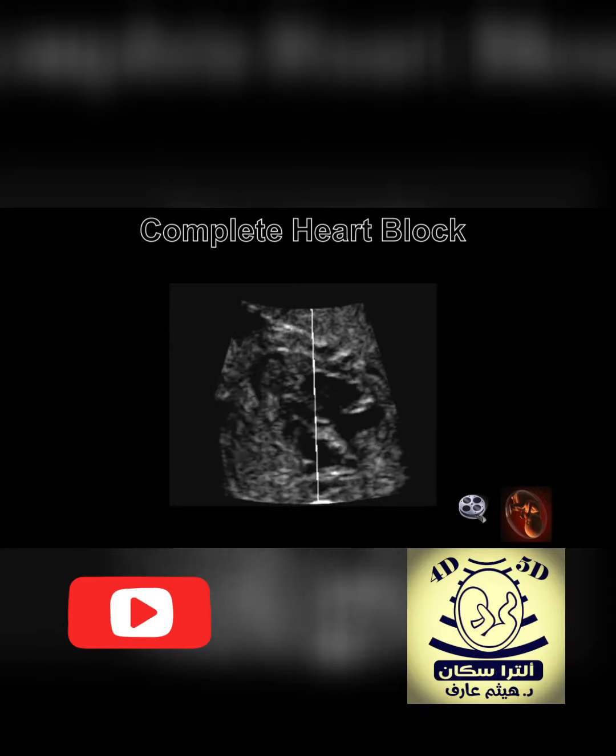A third category of bradycardia is complete heart block, observed in fetuses with a structural heart defect or maternal antibodies transferred across the placenta from a mother with connective tissue disease. The cine clip illustrates a heart block with the atrial chambers contracting at a different rate than the ventricular chambers.